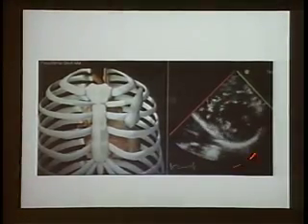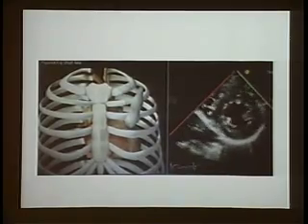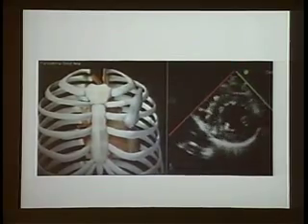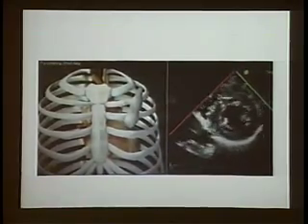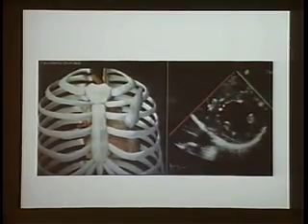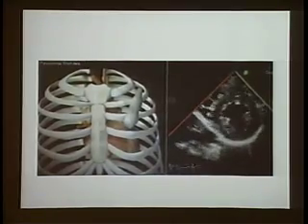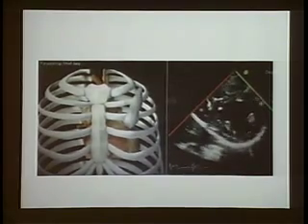And this is going to give you a very easily recognizable view, which is your short axis parasternal view, or your mid-papillary view. You see here the LV, you see the papillary muscles here. It's a good way to assess contractility and also volume status, okay? At the same time, you can even see the different regions of the heart. We're going to talk about that in the next lecture. So if there's a problem with a particular coronary, certain areas are going to go down, and you can see that and have an assessment of where the problem could be in terms of coronary location, okay?